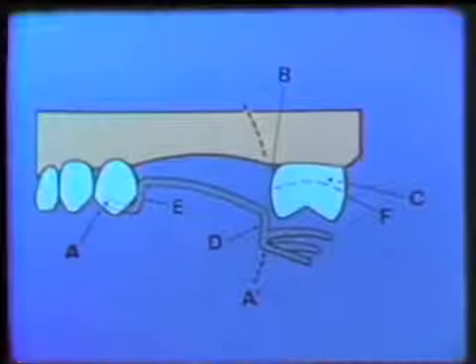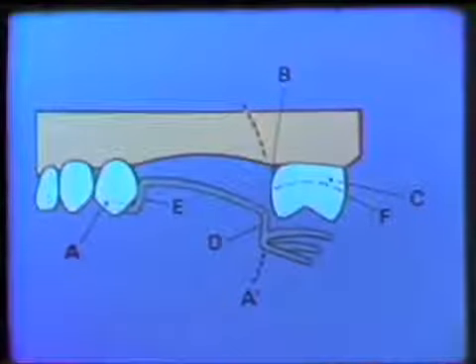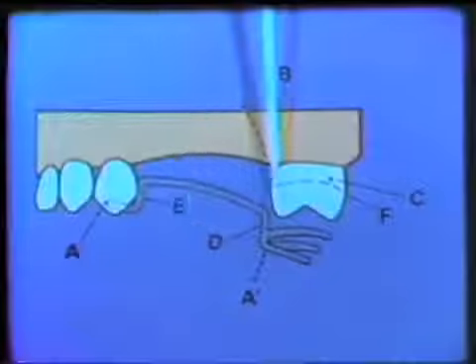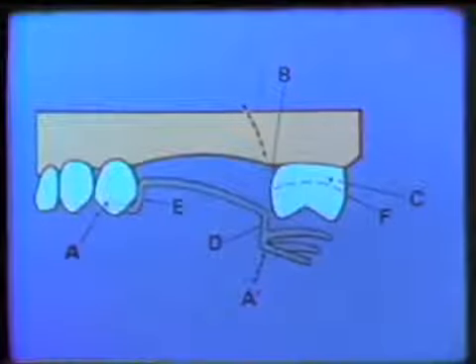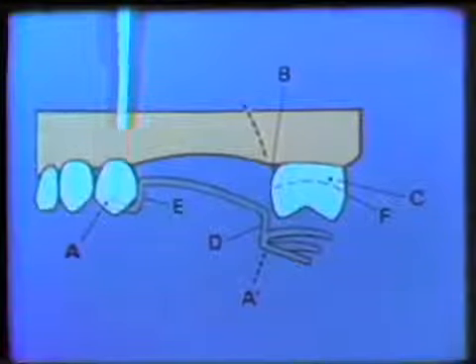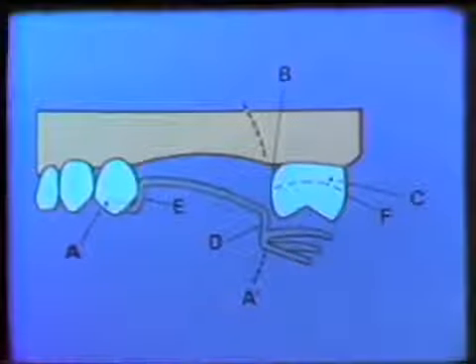Replacement of maxillary posterior teeth with a rotational path denture is accomplished in a similar manner, except that the framework will follow an antero-posterior rotational path of insertion. Point A is the anterior-most point of the long occlusal rest and is the center of rotation as the framework is rotated into position.